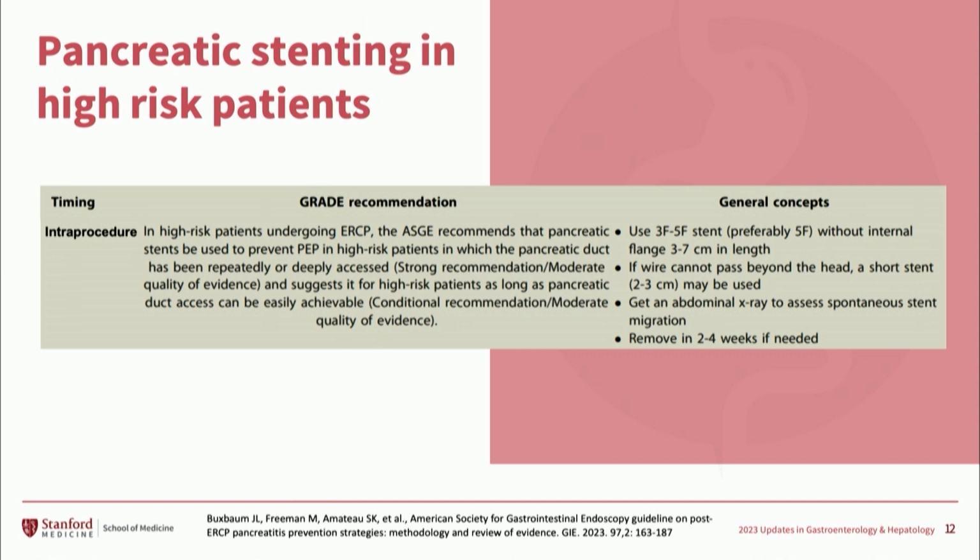In high-risk patients, pancreatic stents are recommended by the ASGE, and in particular, what they suggest here is for patients undergoing ampullectomy, precut sphincterotomy, with a history of post-ERCP pancreatitis, or difficult cannulation, provided that PD access can be easily achieved.